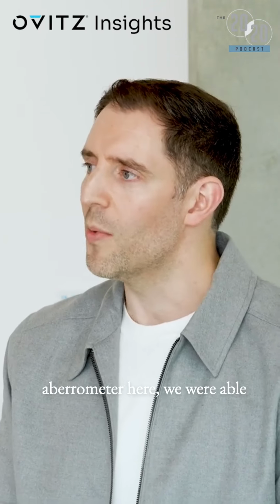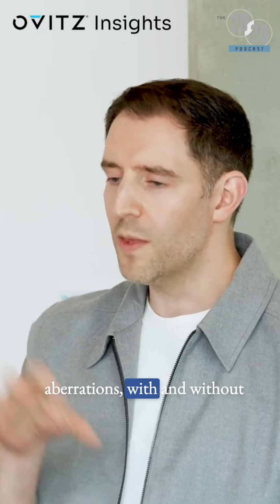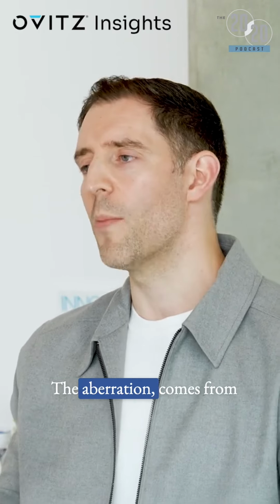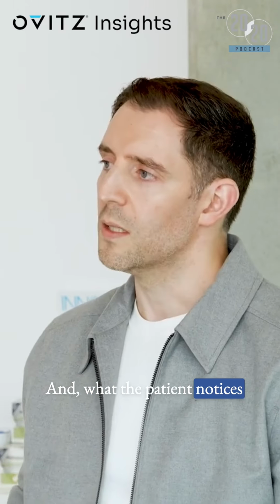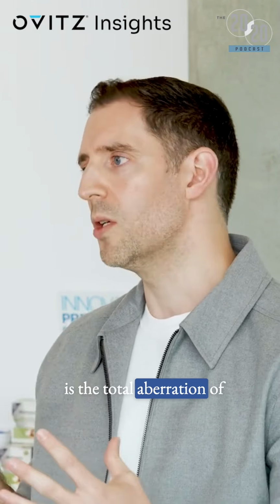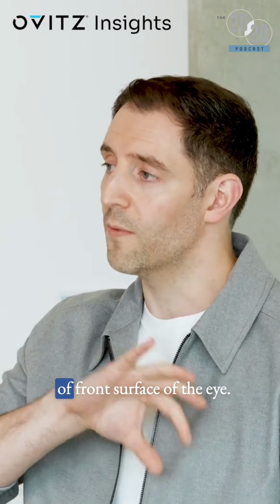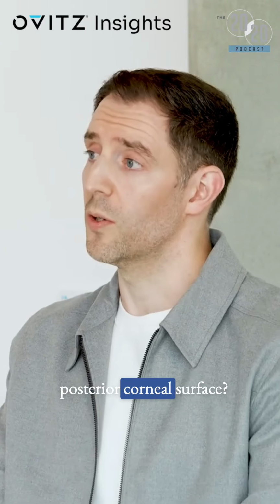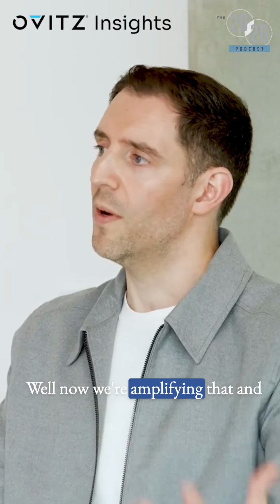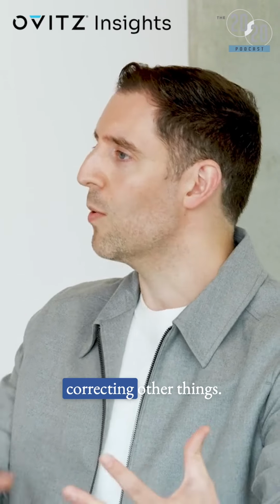Well, having the aberrometer here, we were able to measure and quantify his aberrations with and without the lens. And it was true. The aberration comes from so many sources, right? And what the patient notices is the total aberration of their eye as an optical system. Now, the scleral lens only improves the front surface of the eye. What if there's a lot of residual aberration from the posterior corneal surface? Well, now we're amplifying that, and the patient's noticing that more, even though we're correcting other things.